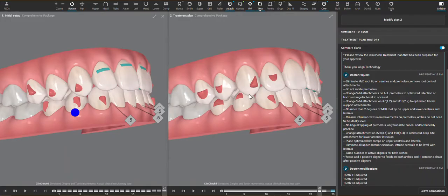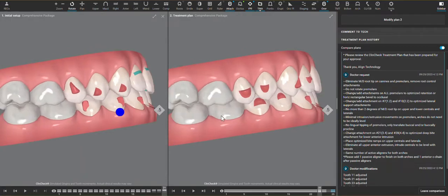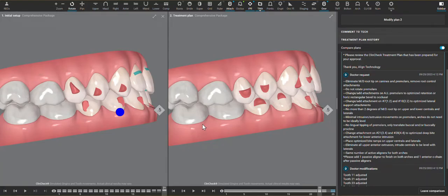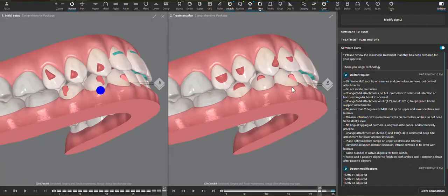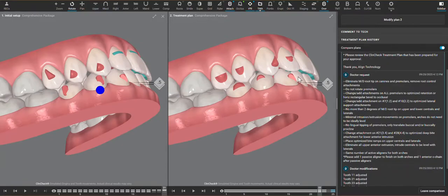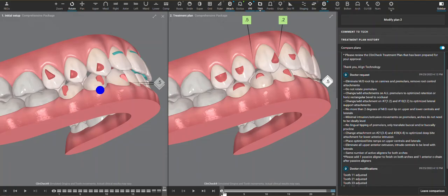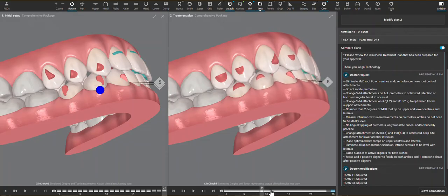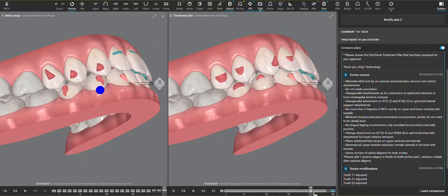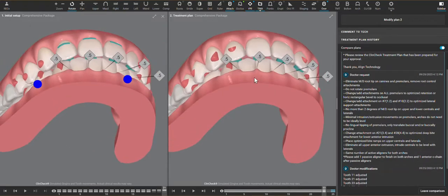Also, without bite ramps, it's a very high chance that the molars will passively intrude away from each other just from wearing tooth to tooth with the aligner plastic on such a wide occlusal table. So if the bite ramps are here, the posterior is going to be disoccluded and we are far less likely to see a posterior open bite for that reason.